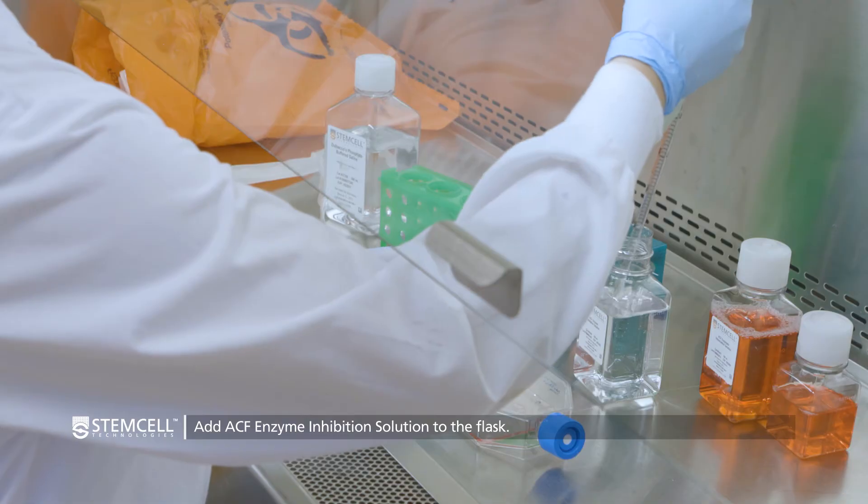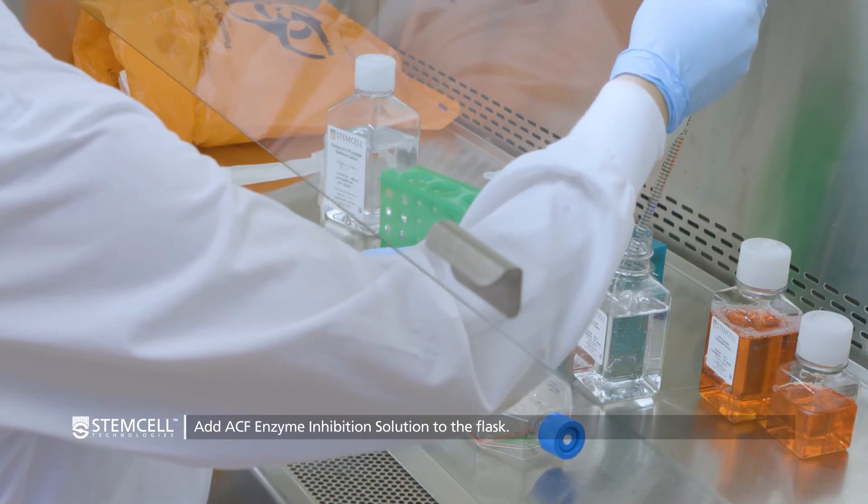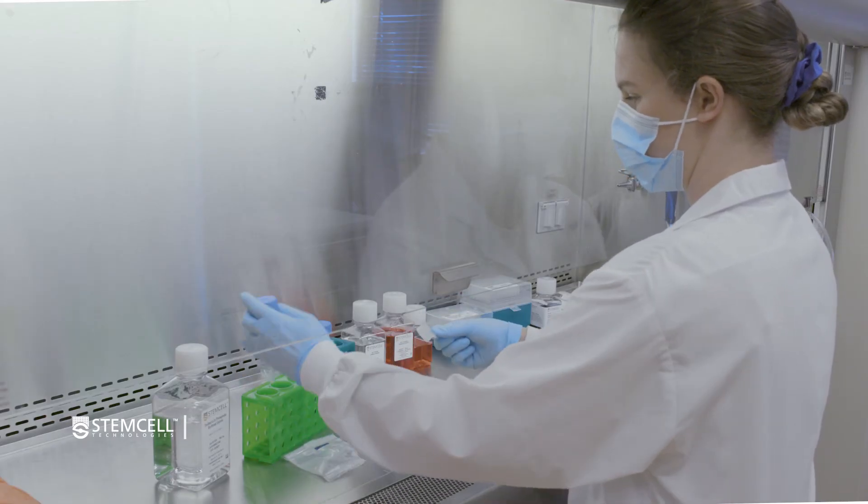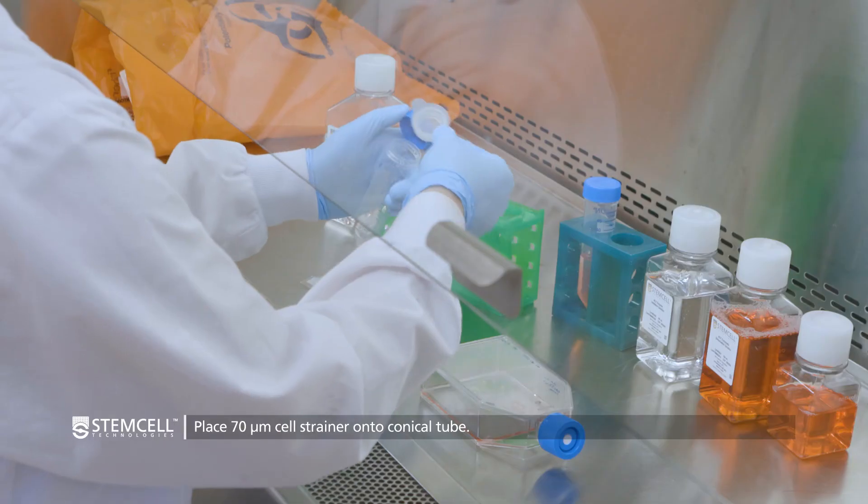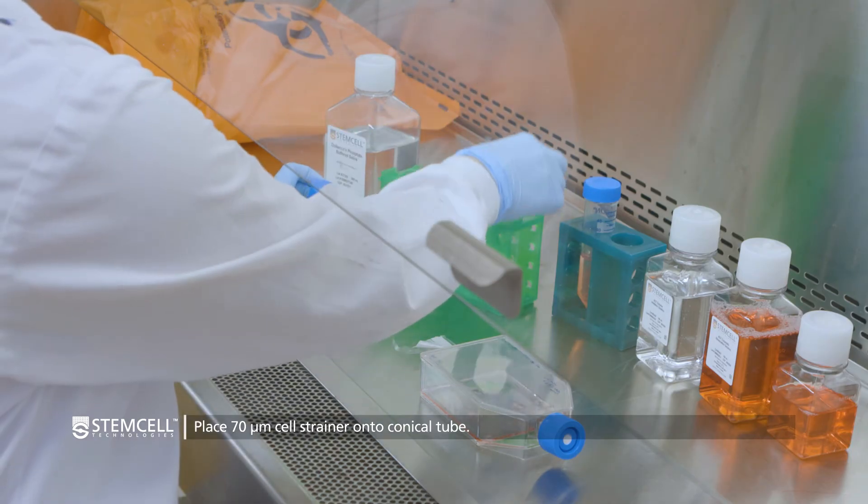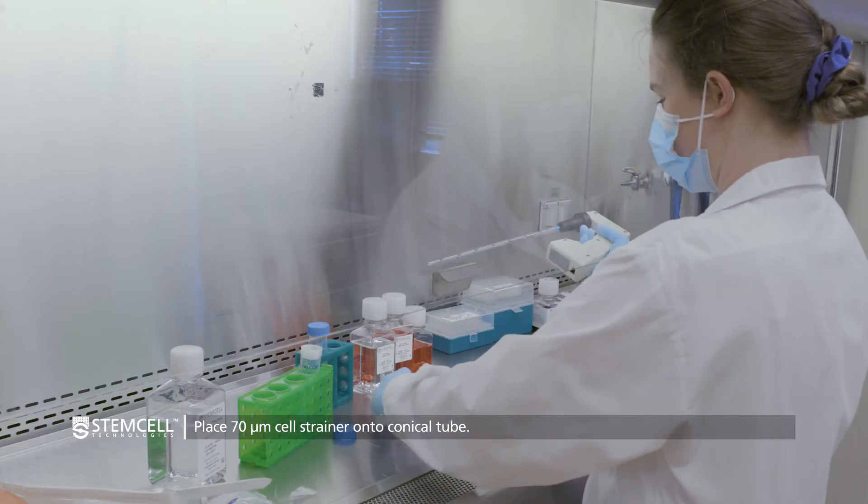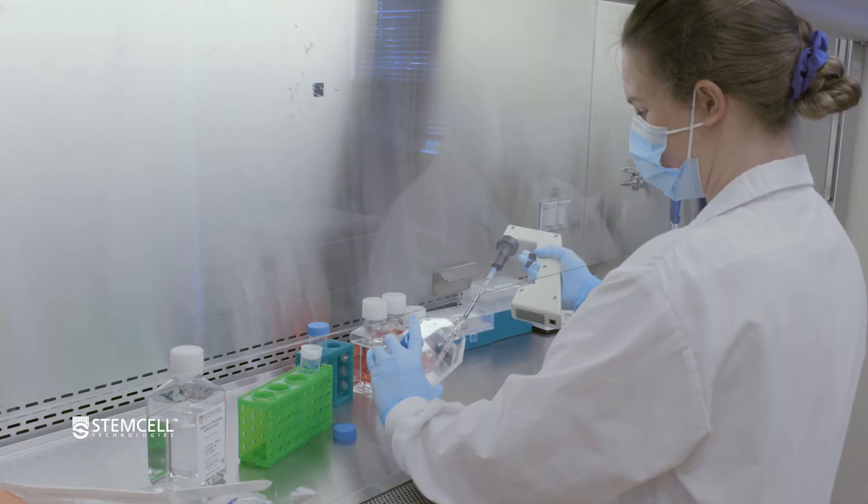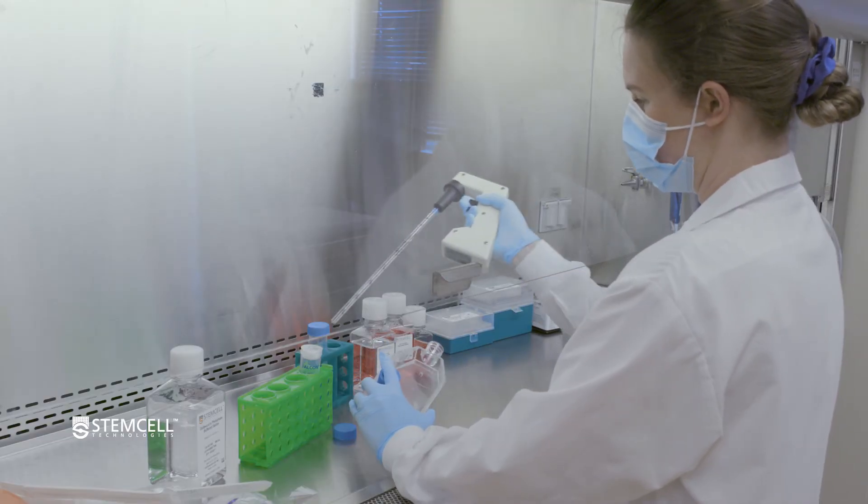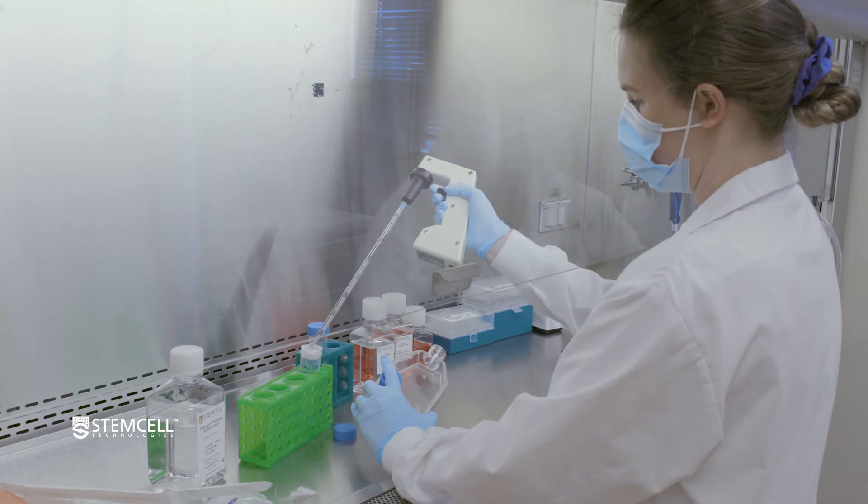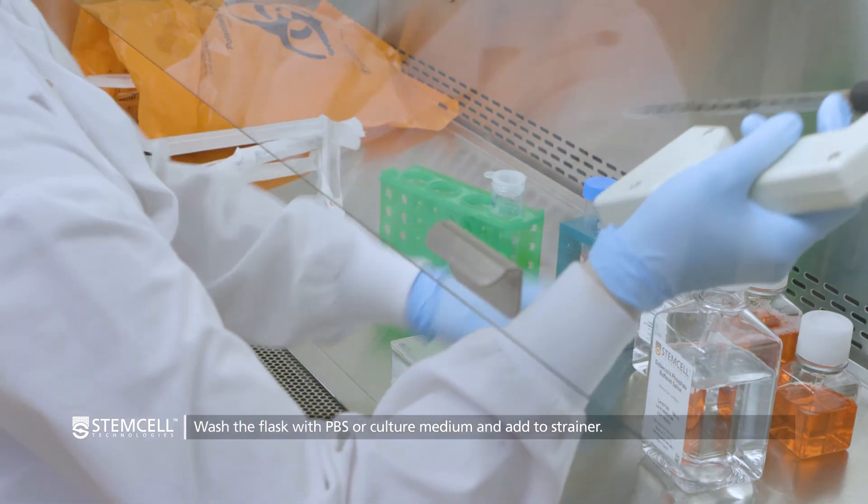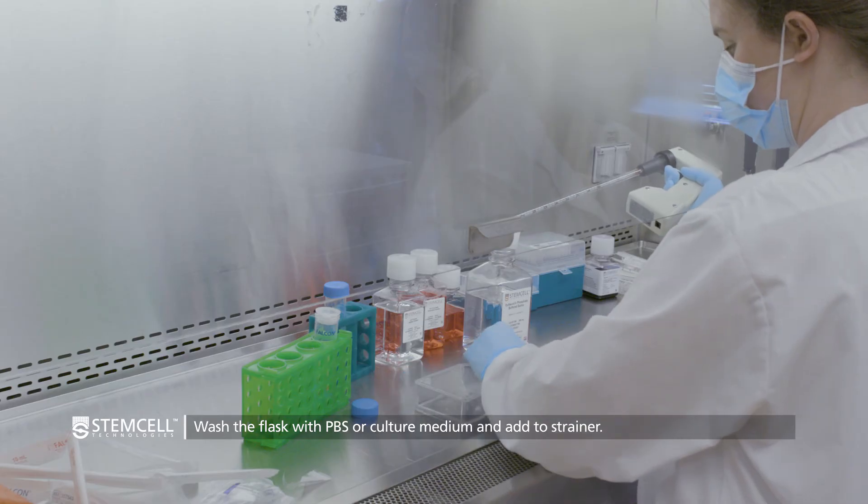Add 5 ml of ACF enzyme inhibition solution to the flask. Place a 70 or 100 micron cell strainer on a 50 ml conical tube. Remove the cells and tissue solution from the flask and strain to separate the tissue from the single cells. Wash the flask with about 10 ml of PBS or culture medium and add to the cell strainer.